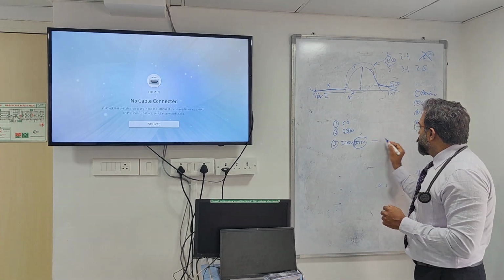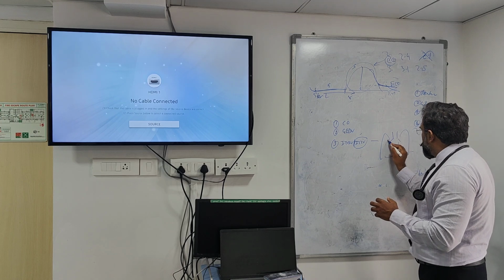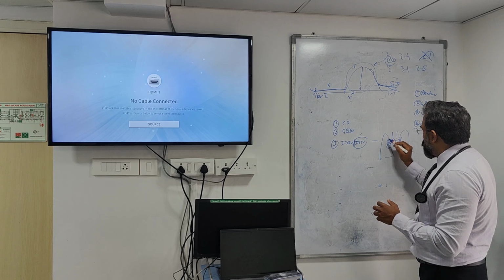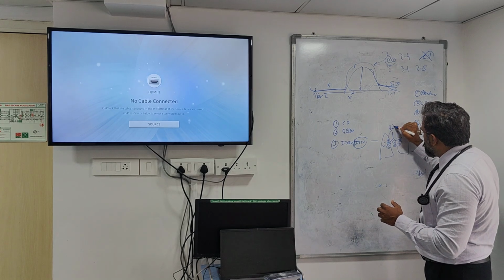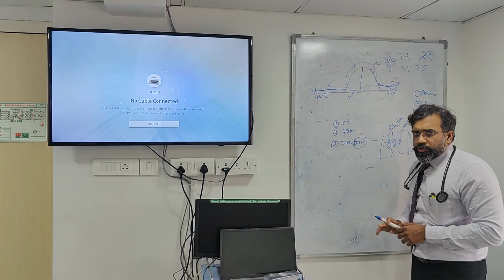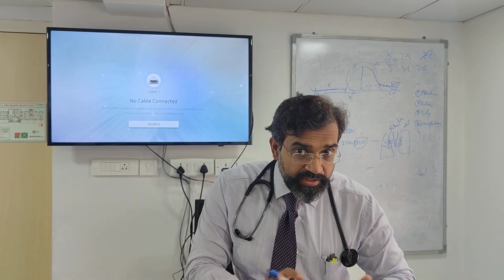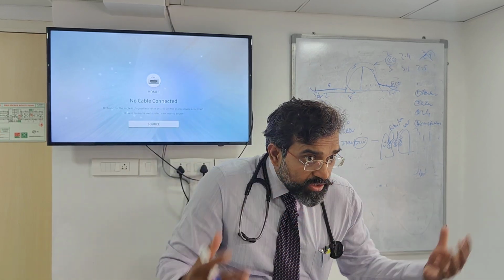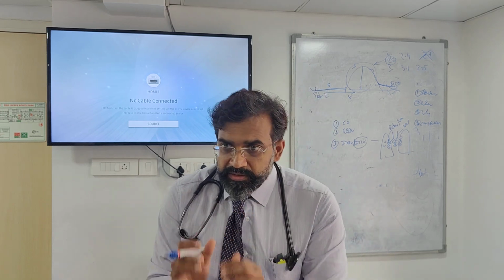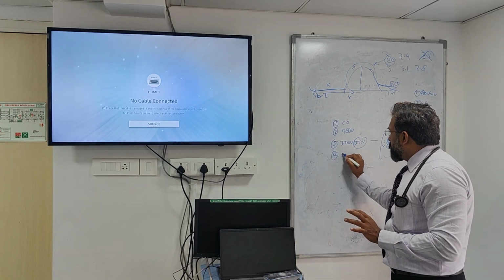What is this? This is a combination of what is there in your entire lungs plus what is there in the hilum plus what is there in the heart. So lungs plus vasculature, hilar vasculature plus heart. So it is showing you what is there in the lungs, what is there in the vasculature inside that particular thorax, and what is there inside the heart. Clear on this? So the next step you get is pulmonary blood volume.